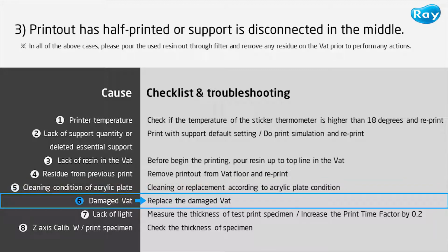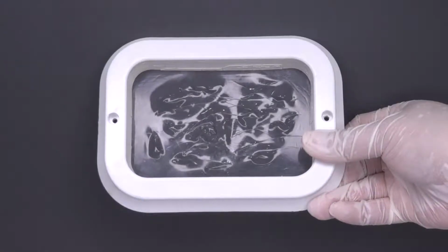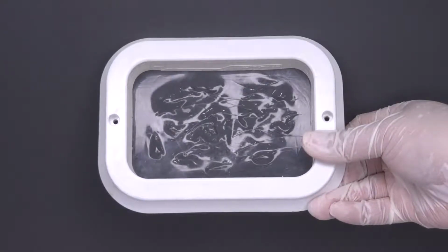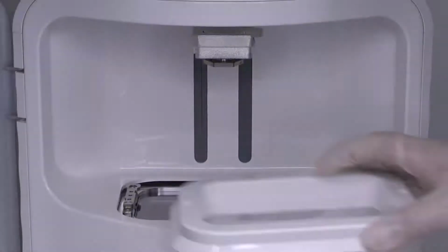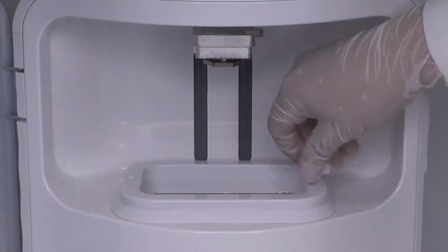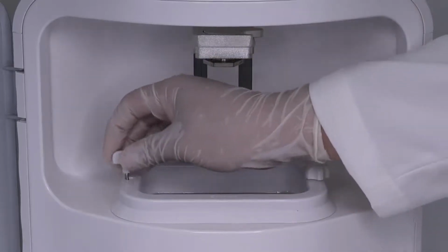The sixth cause is the damaged vat. A damaged vat also affects the quality of print outcomes. After removing the resin, check the condition of the vat and replace it with a new one if it's damaged.